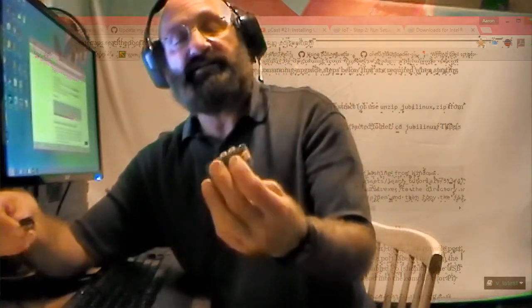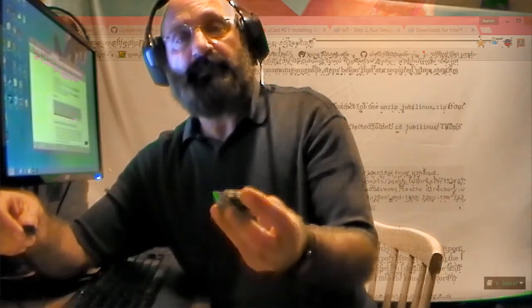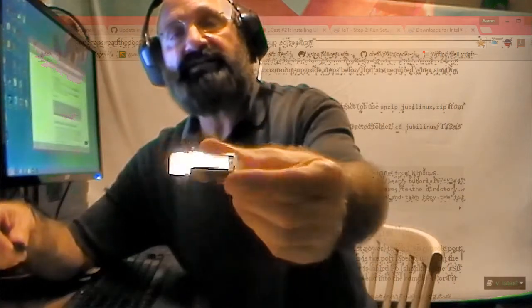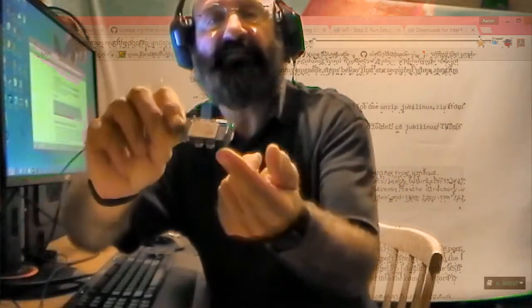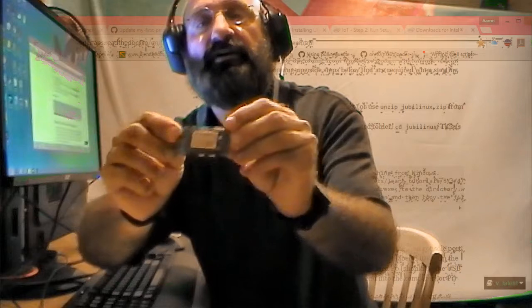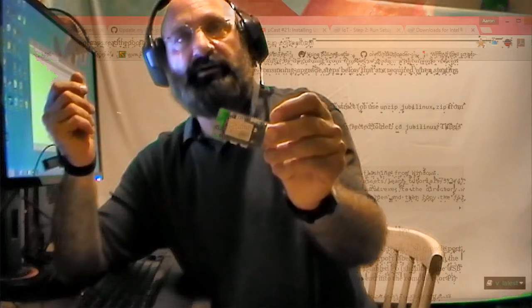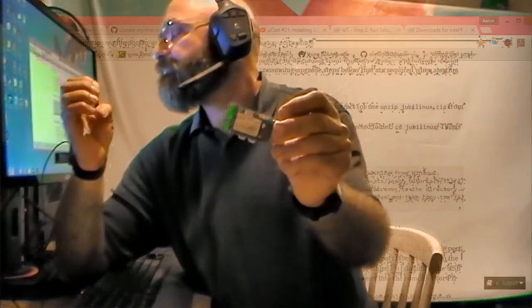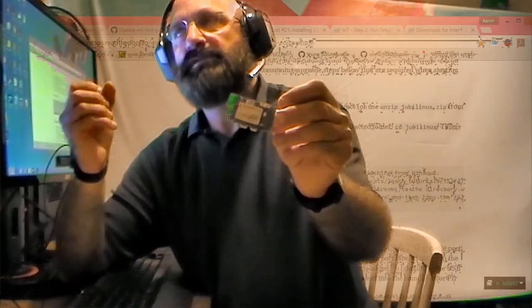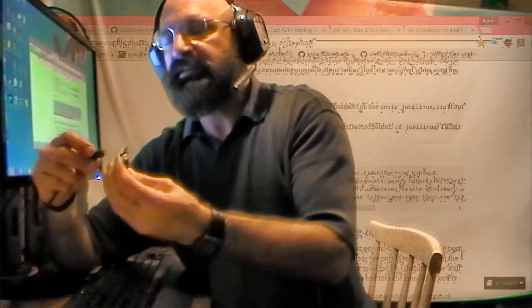What I'm going to do is connect to, let's try, because OTG is going to be for flashing, and UART is going to be for serial, looking at the serial port. So the serial port. Okay, so we're going to power it up through the serial port. One that says UART.